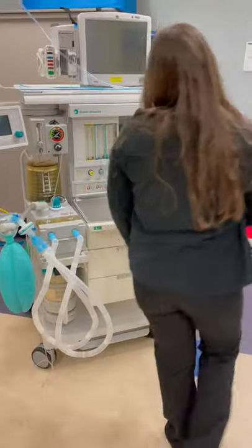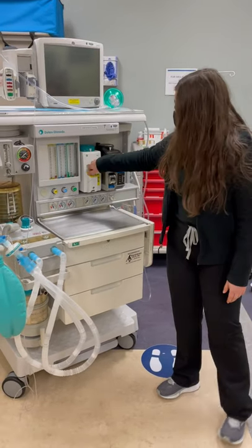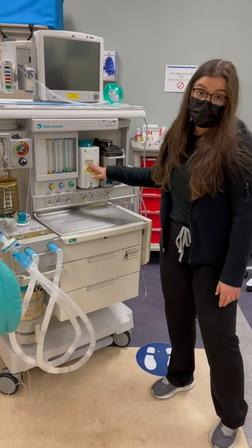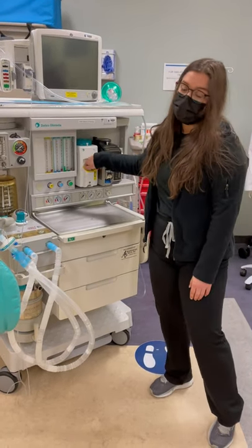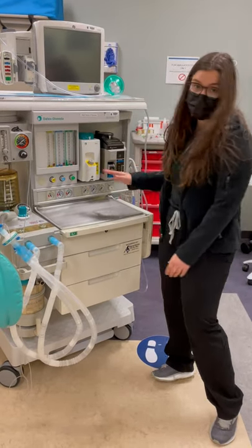I'm going to come over to my vaporizers. I'm going to make sure that they're full. If they're not full, these are specific keys for the vaporizers — when you fill it up, the idea is you can't put sevoflurane in desflurane because the key is not going to line up. So that's something I would do before I even do my machine check: make sure my vaporizers are full.